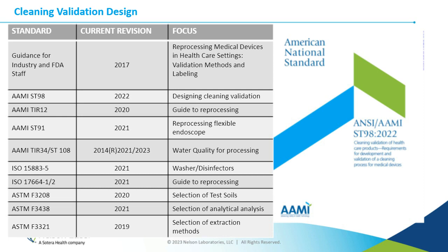It is to design a cleaning validation and what you need to have in the design for the validations to be successful for submissions. That is what's written in the standard; it helps you design the validation. So if you're not familiar with the standard, I would suggest that you do get familiar. It was published last year in August.